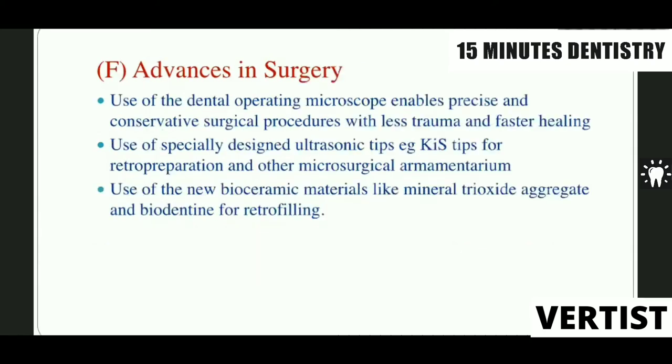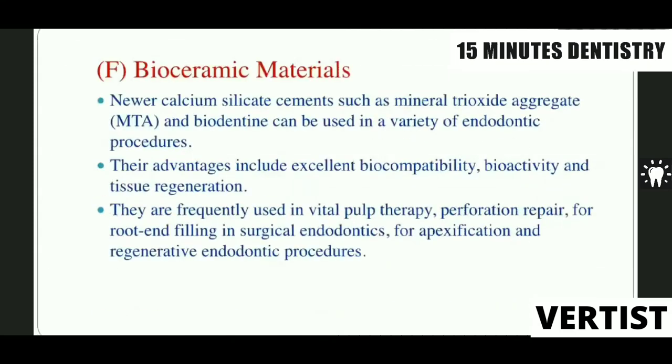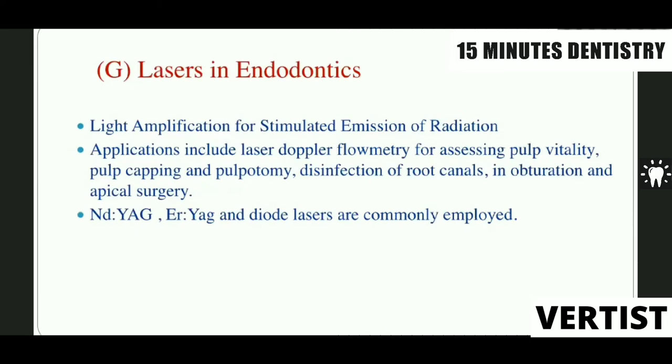And advances in surgical methods, where the use of microscope and magnification has become very important. Use of the ultrasonic design tips for your retro end preparation. Use of different materials like your ceramic materials, MTA and Biodentine for retrofilling. We have your MTA again, which is very frequently used for repair of all the perforations, as a root end filling material for apexification as well as your regenerative endodontic procedures.